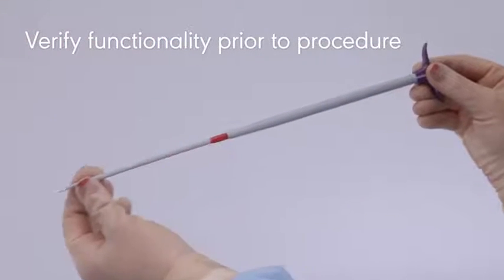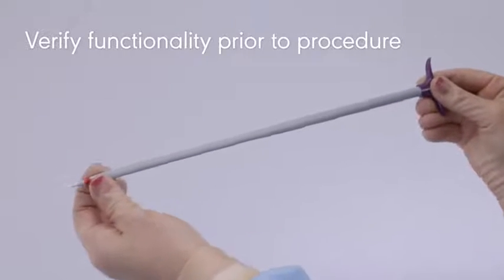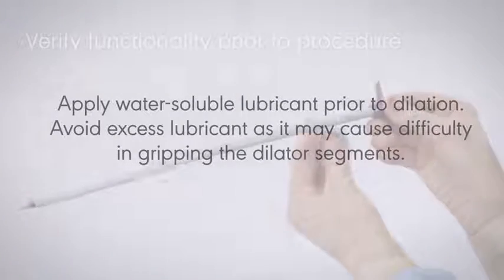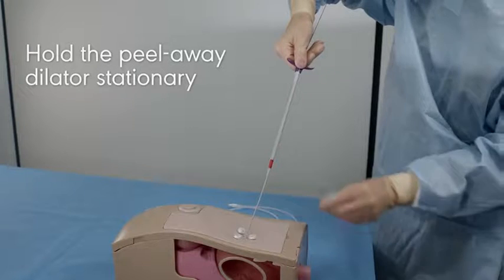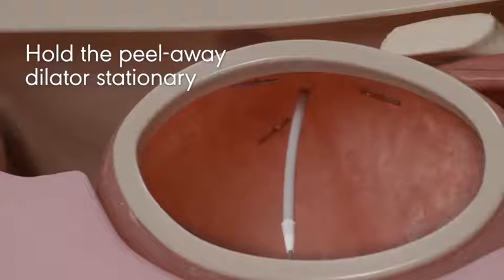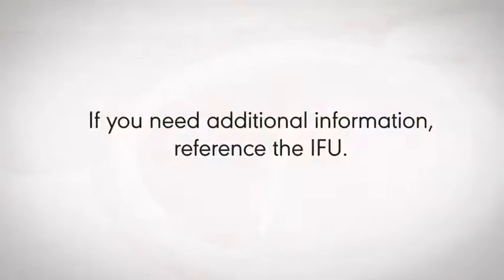Verify functionality of the telescoping dilator prior to the procedure by advancing each dilator sleeve distally until the physical stop is felt. Apply water-soluble lubricant prior to dilation. Avoid excess lubricant as it may cause difficulty in gripping the dilator segments. Once positioned, hold the peel-away dilator stationary during the procedure to prevent it from migrating further into the stomach.